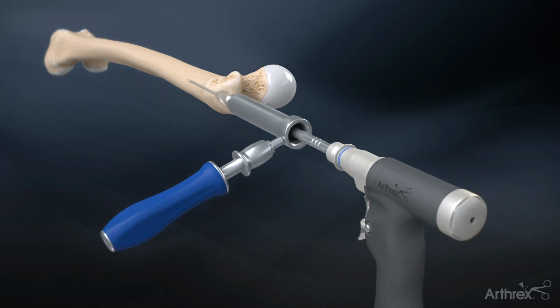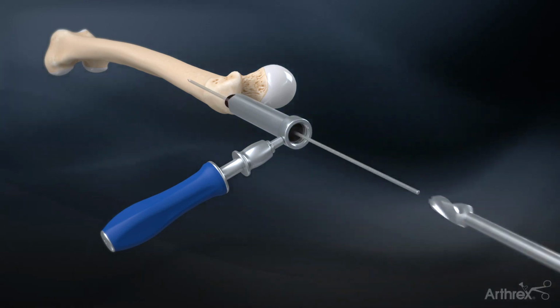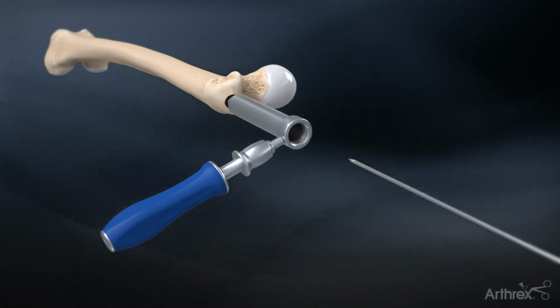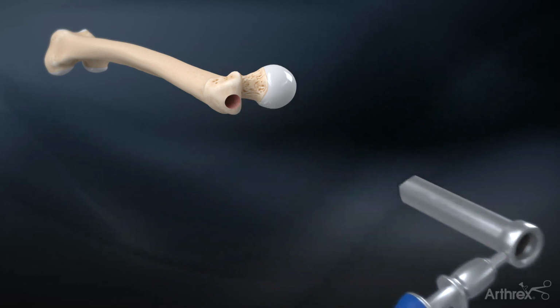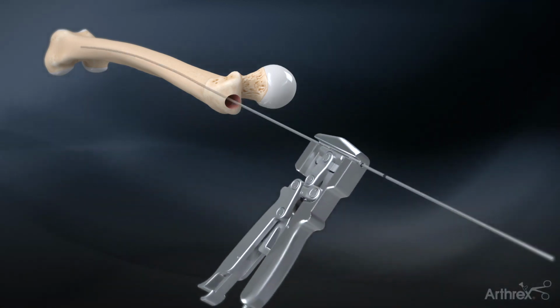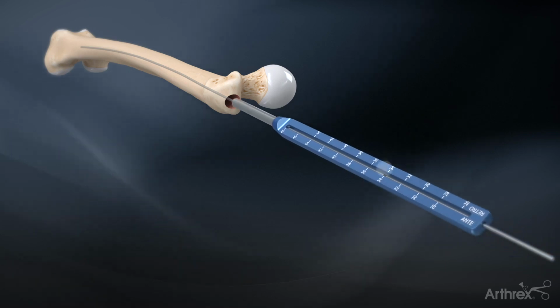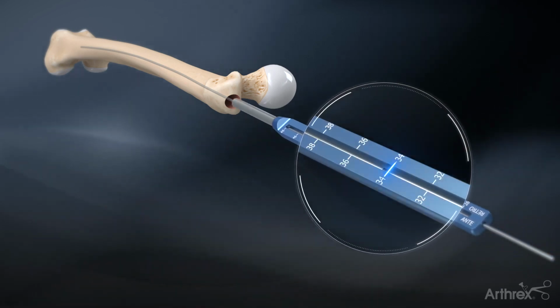The depth is determined by the first indentation of the reamer lining up with the top of the soft tissue protector. The 3.2 mm guide pin is removed, as well as the soft tissue protector, and the 3.0 mm ball nose guide wire is introduced down the shaft of the femur using the guide wire gripper. Measure the length of the ball nose guide wire with the guide wire depth gauge from the laser etch line to determine the nail length.